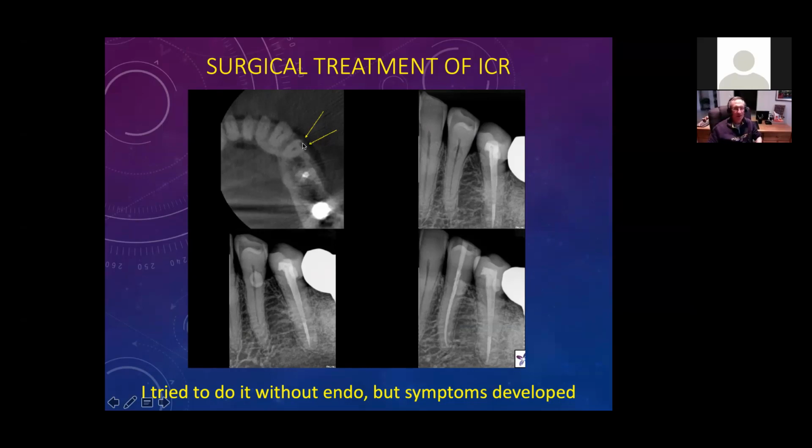Yeah, and a lot of liners are made of glass ionomer materials. There's a couple of the old Mick Dragoo articles about using a composite, Geristore, for restoring these, and that's fine. You can do that if you want to, but it doesn't have any magical properties. I've done some with it. Geristore doesn't polish very well, and there are more steps to it. You're supposed to use it with a dentin bonding agent, and I like just using glass ionomer, resin modified glass ionomer. Isolation sometimes is an issue with these, and so I just want to get in there and restore it. And with glass ionomer, it doesn't require any kind of pulpal protection. Thank you. Yeah.